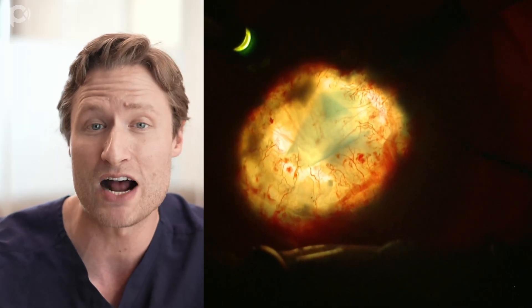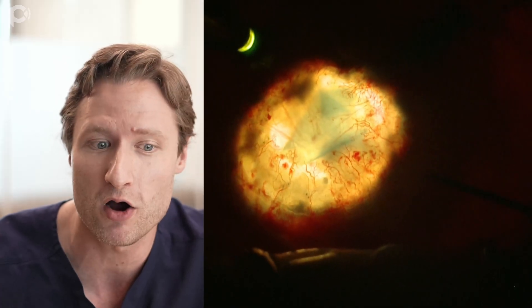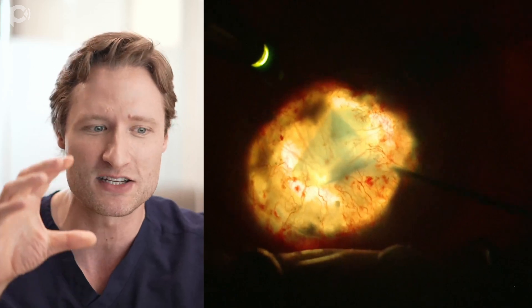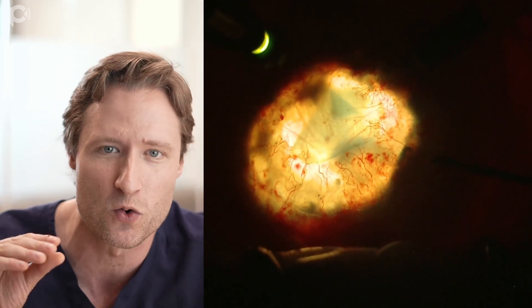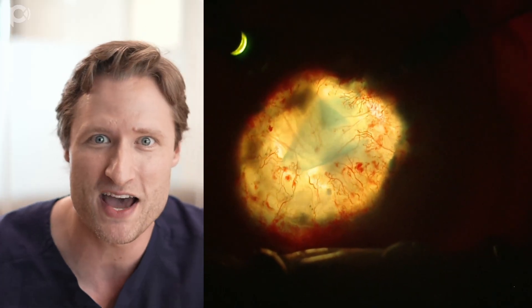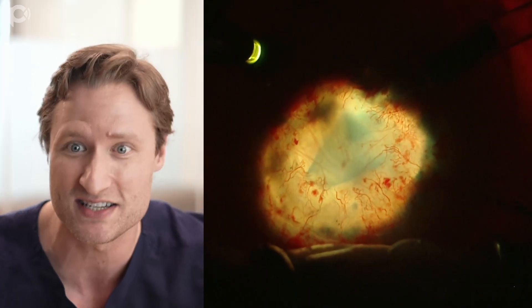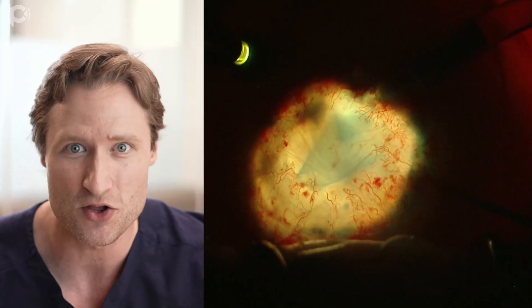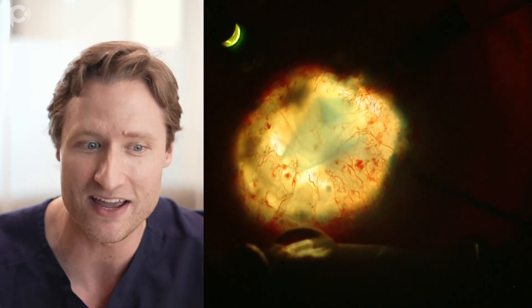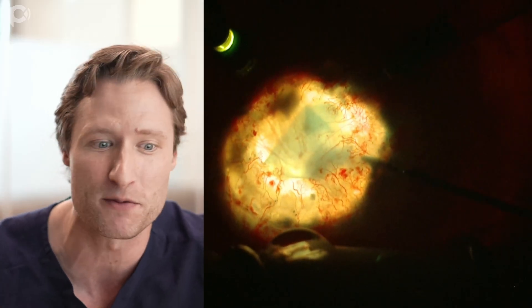I just want to deepen things up a little bit so I can get that edge of the graft to come out. Something that probably would have made my life easier would have been to do a pars plana vitrectomy, which would have released the tension between the front of the eye wall and the back of the cornea, allowing the graft to unfold. People think DMEK is more difficult in vitrectomized eyes or eyes with a hyper-deep chamber with an AC IOL - it's not. Those are much easier cases. The harder cases are ones like this where there's no room between the back of the cornea and the front of the iris.